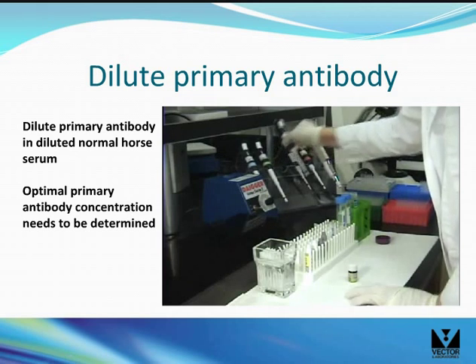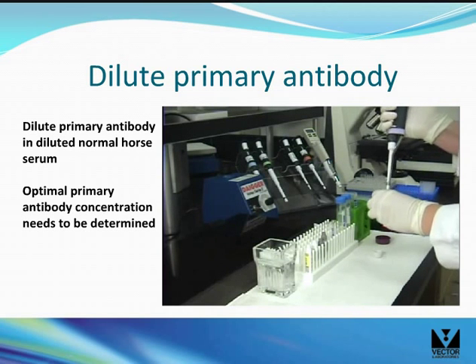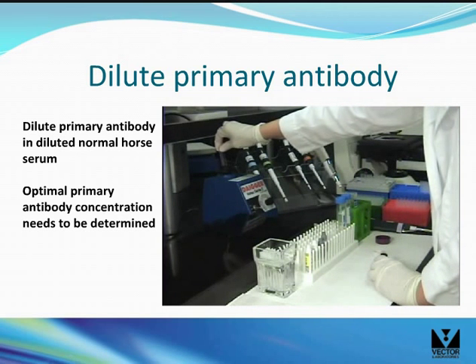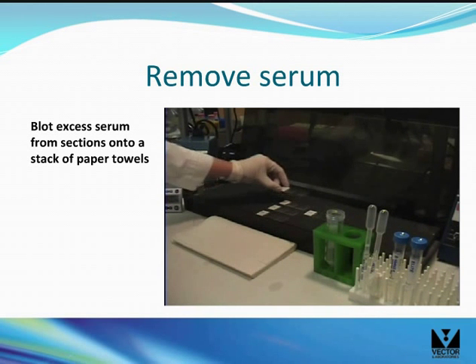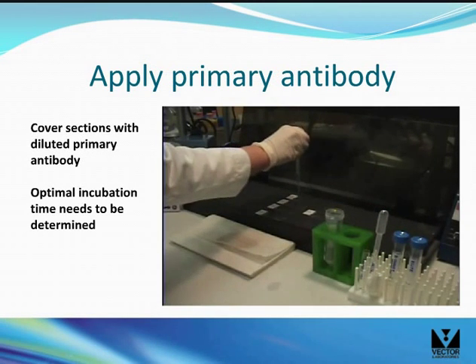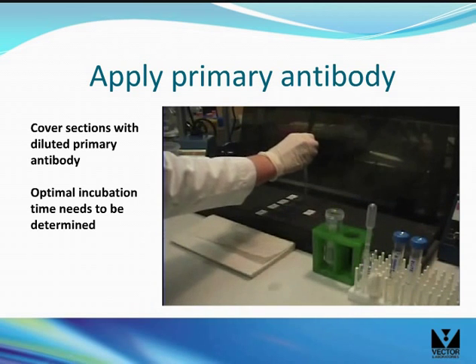Dilute the primary antibody in diluted normal horse serum. Optimal dilution needs to be determined. If your antibody is commercially available, a recommended range may be supplied. Tip off the excess serum from the sections onto a stack of paper towels as shown. Cover the section with the diluted primary antibody solution. The optimal incubation time needs to be determined; a recommended range may be supplied by the antibody manufacturer.